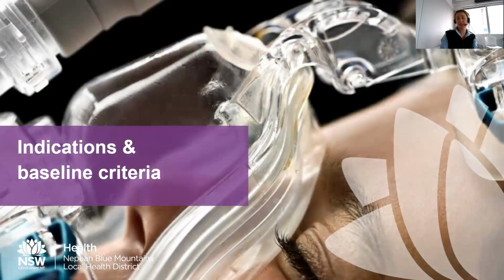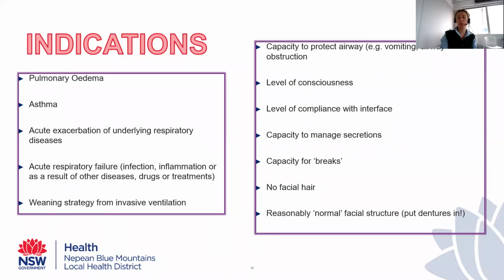All right, so some indications and baseline criteria. So indications, pulmonary edema we've talked about. If someone has acute pulmonary edema, it's normally CPAP that we're putting them on. We just want that end expiratory pressure to push all that fluid back into the circulation. CPAP can be very useful in asthma. Usually CPAP, but both CPAP and BiPAP are used when we have a patient who has an underlying respiratory disease, whether that's COPD, fibrosis, asthma, and now they have an acute exacerbation of that illness. So they might have a chest infection on top of that. They might have a pneumonia, whatever it may be.